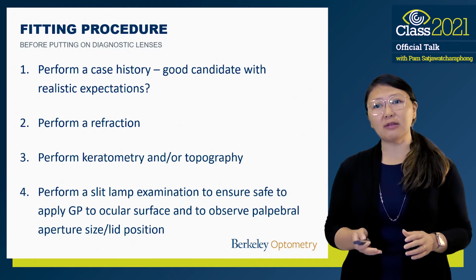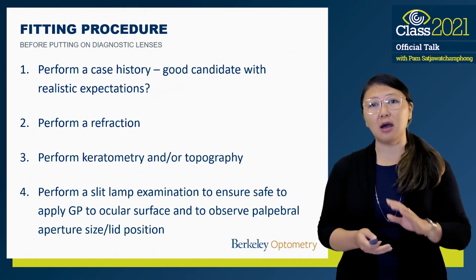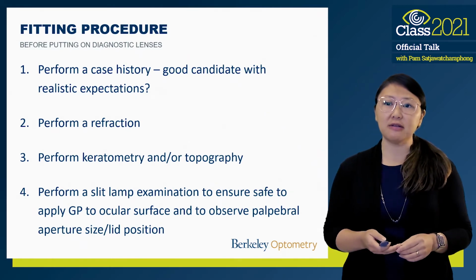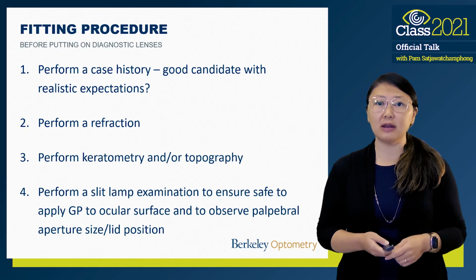And then I like to perform a slit lamp evaluation to make sure that the ocular surface is healthy, and I want to look at palpebral aperture size and lid position because this will be helping me in my initial lens selection.